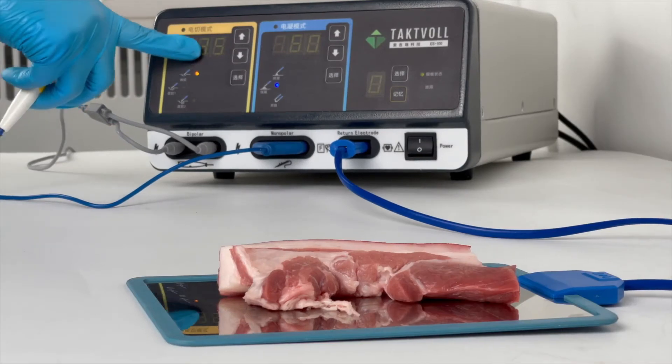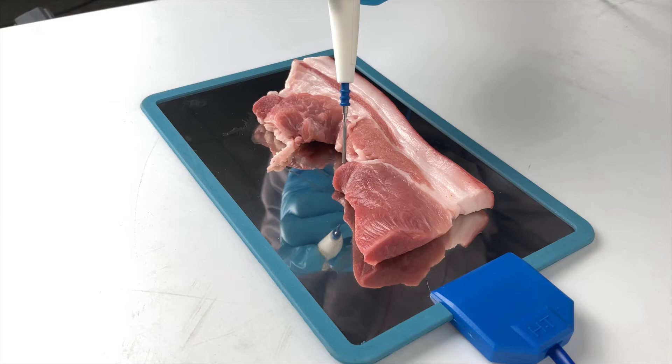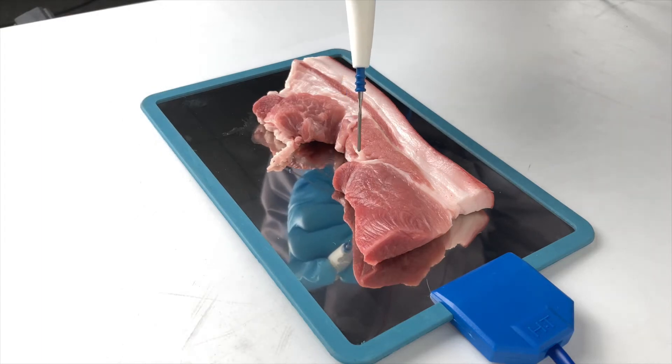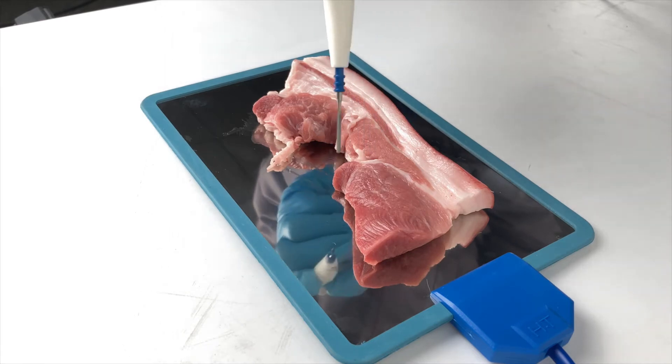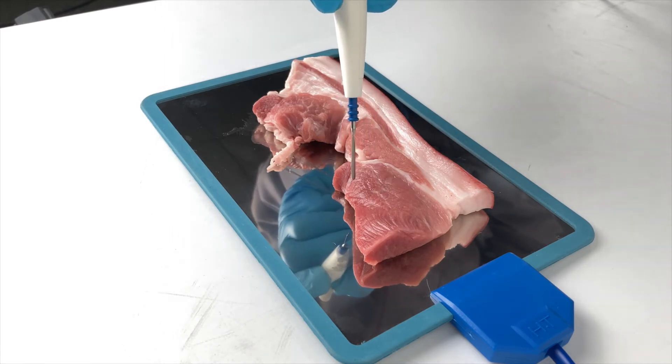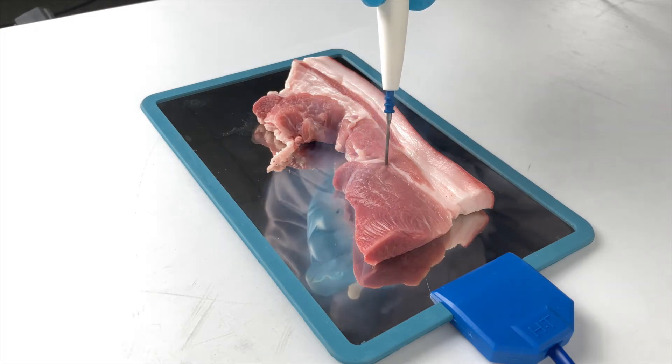Select the Pure Cutting Mode. Turn the power to 35 and press the yellow button. Due to the unique tissue feedback technology, the generator can guarantee continuous output even when facing different densities of tissue, making the cutting smooth during the operation.